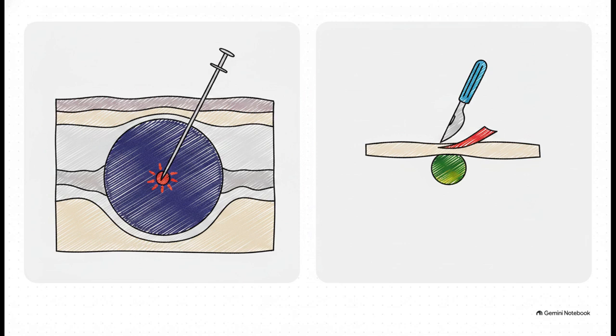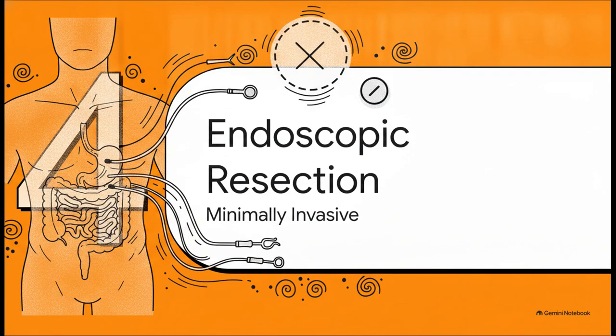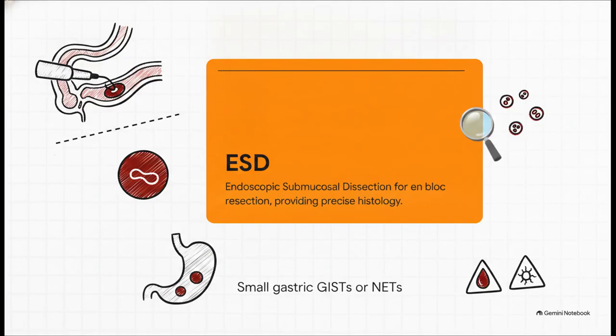With MIAB, you actually incise the mucosa to directly expose and biopsy the lesion. It's a total game changer for those incredibly frustrating, tiny yet suspicious nodules. Section 4, modern endoscopic resection options. So once you've got a diagnosis, it's time to take action. This is where we pivot to those minimally invasive marvels that are rapidly replacing old-school surgeries.